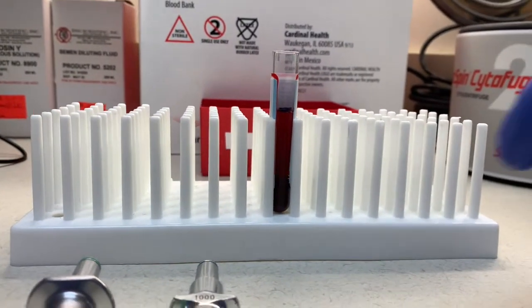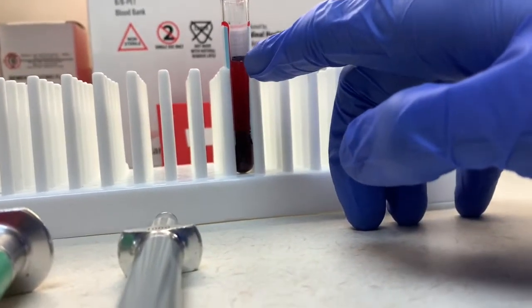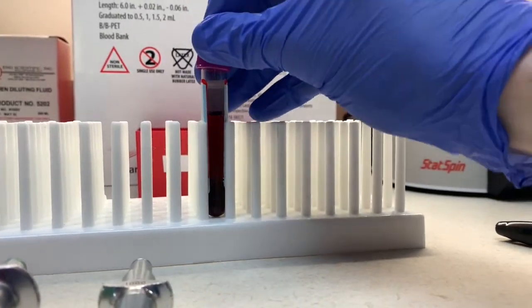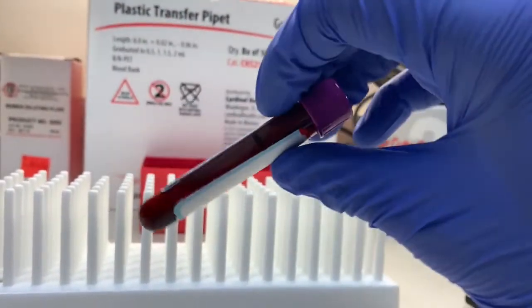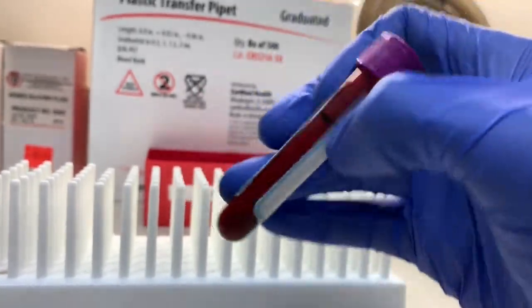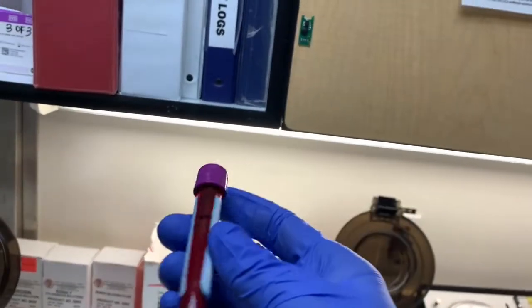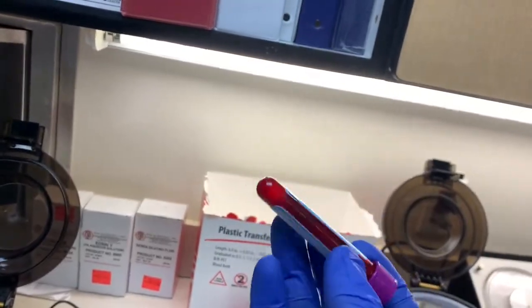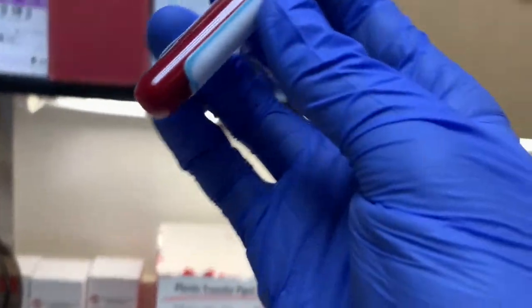So now what you should have is some cells on the bottom and a bunch of saline up top, exactly at that line where you marked. You're going to take the tube, you're going to invert it a bunch of times to re-homogenize everything and make sure that the red cells aren't sticking to the bottom. After mixing it 10, 15, a ton of times, make sure this is really well mixed. You're going to take this sample, you're going to run it on the analyzer, the same exact way you did before. Hopefully the results should look a lot better.